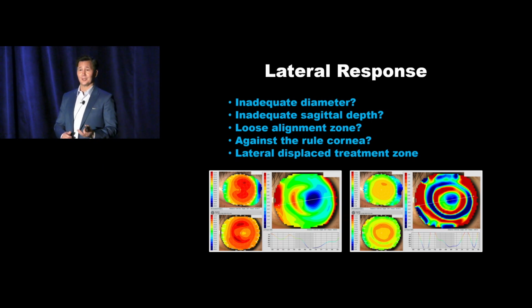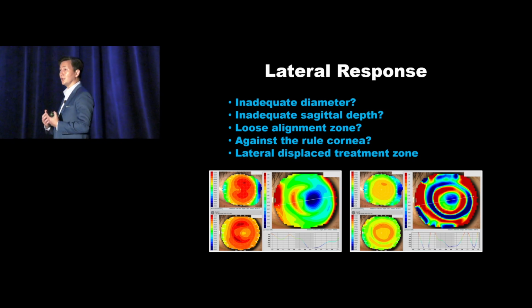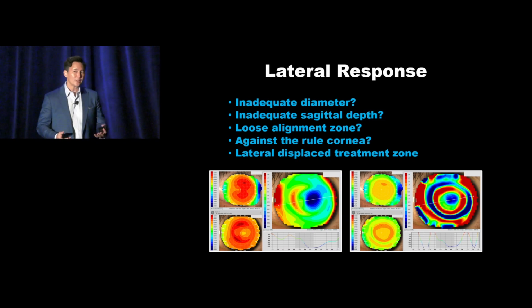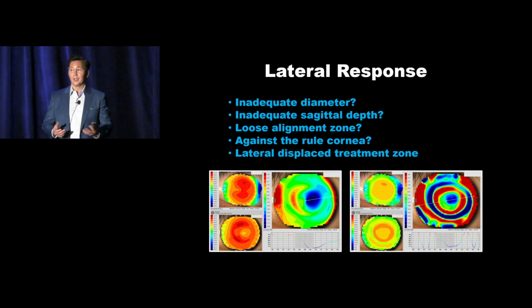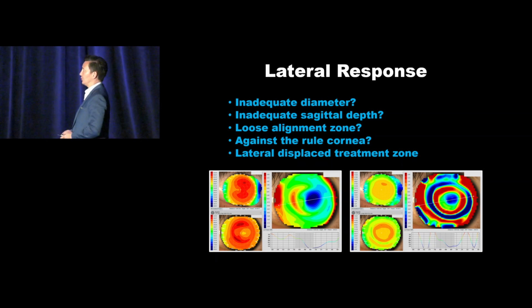And there was a question in the morning session, can we control how patients sleep? And I swear there's times where kids just sleep with a knuckle in their eye and it just totally decenters the lens. It's a perfectly centered, good looking fit before we dispense it, but the patient comes back with an utterly lateral topography on just one eye. So is it related to the sleep? I don't know, but there's these outcomes, especially lateral, where you just can't understand why it's doing what it's doing. So in such cases, bigger, tighter, that's what you have as options.